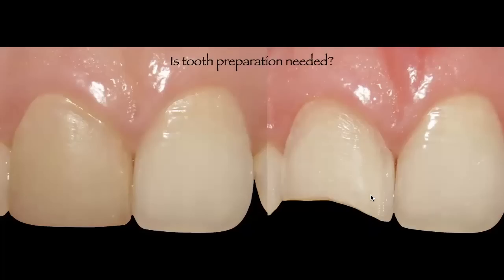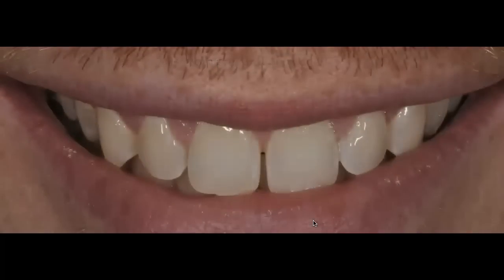So in this particular case, the tooth was prepped. I obviously couldn't control that. But most likely, if this tooth had not been prepped initially, my preparation would have been more conservative. Because again, as you can see on the right hand side, both the substrate of the prepped tooth and the substrate of the natural tooth number 9, the 8 and 9, they both match. So that means that I require very little preparation. And this is how you go about analyzing how much tooth structure you need to remove.